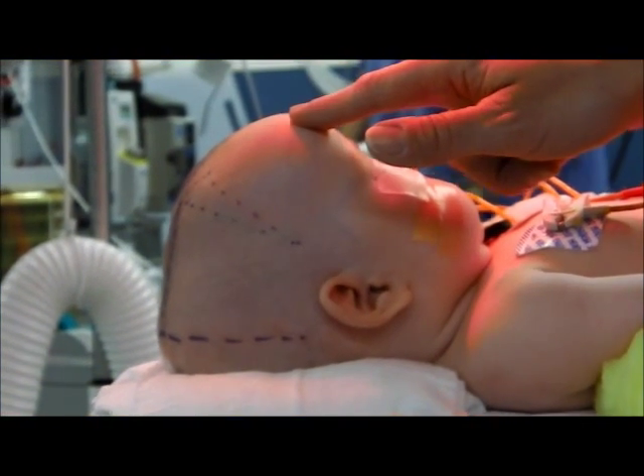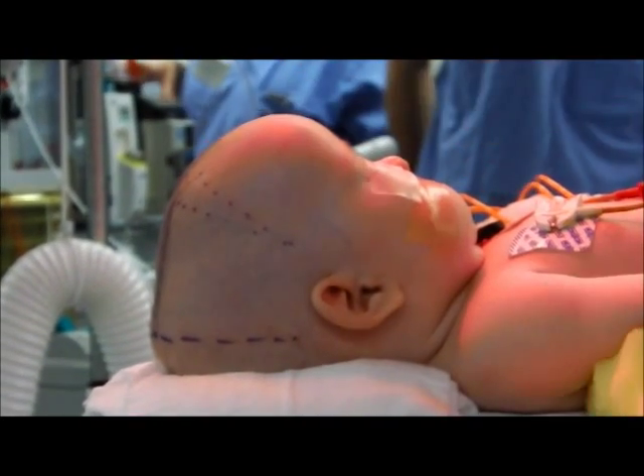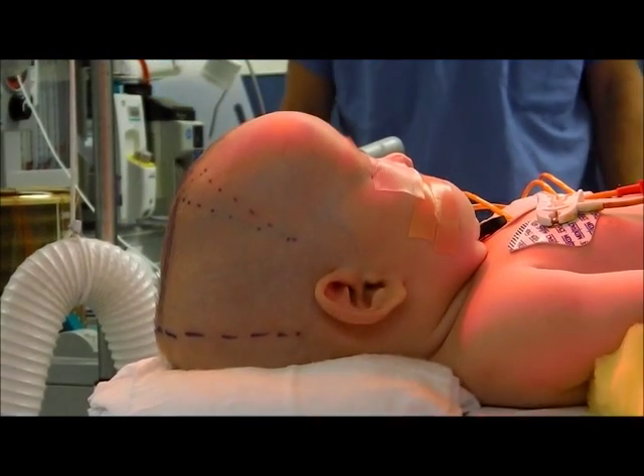This will all be corrected after surgery when the baby goes into a helmet for 6 to 12 months.